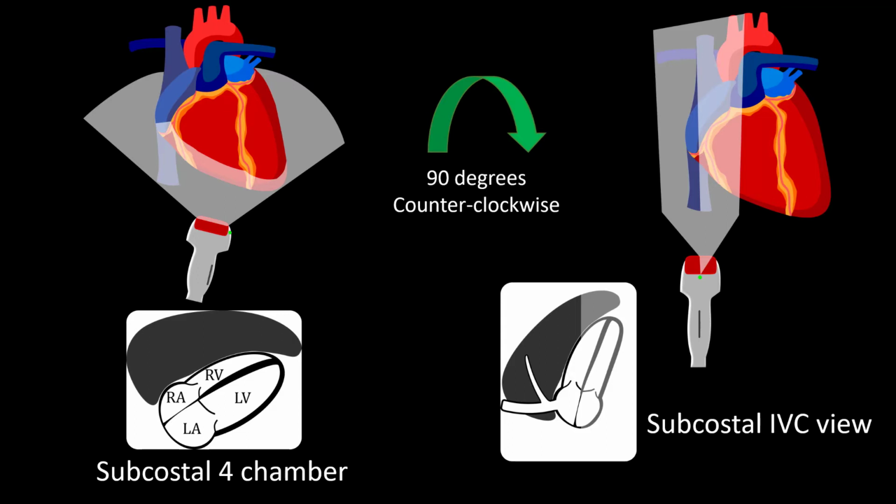You will see the liver in front of the four-chamber heart, lying more parallel than the apical four-chamber on the screen. One trick to find the best location is to start about 1 to 2 centimeters below the ribcage, lateral to the midclavicular point, and then follow the ribcage midline.